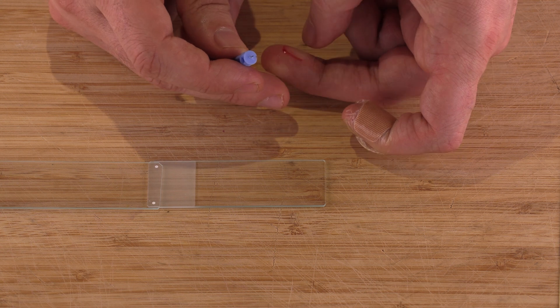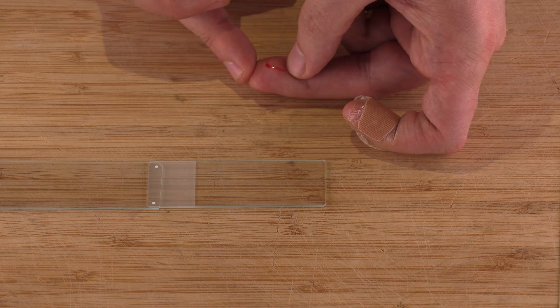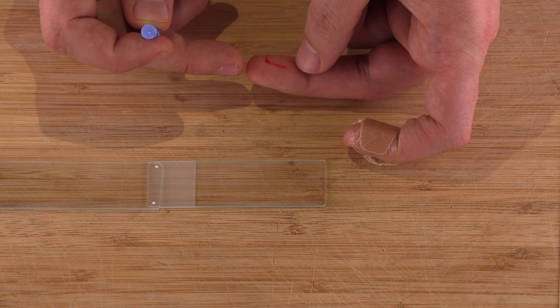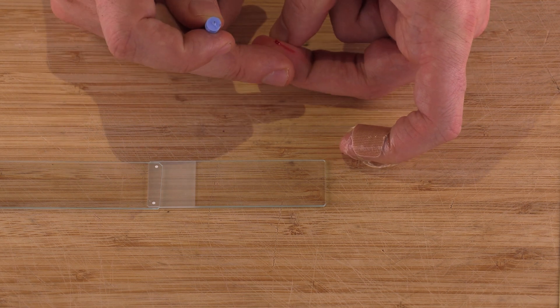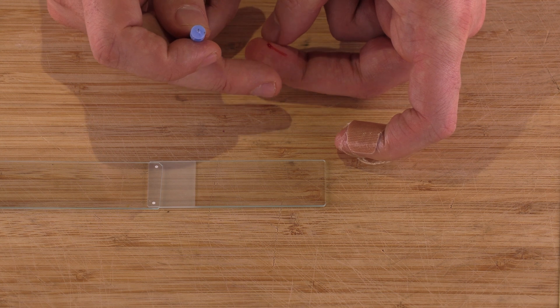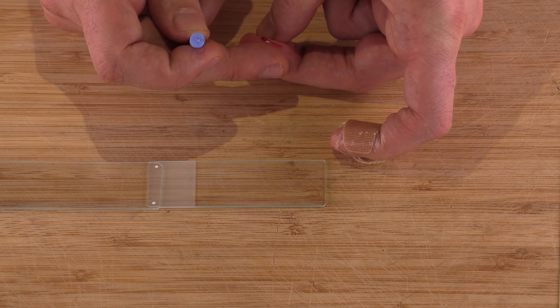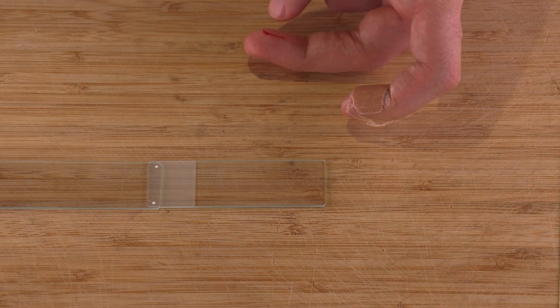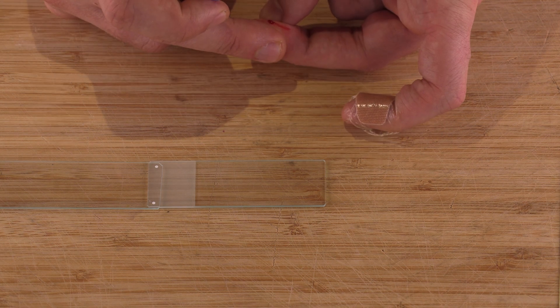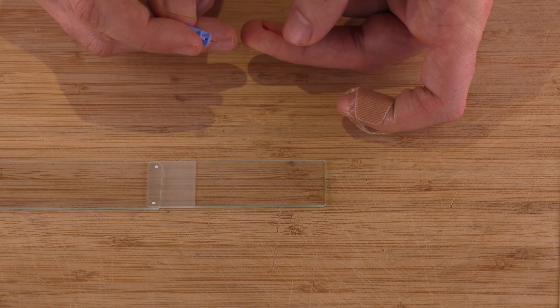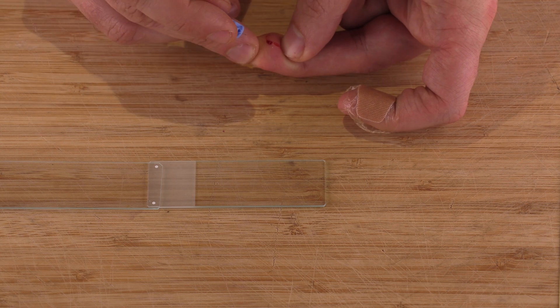Just go easy on it and now I'm trying to just squeeze a little bit more out real gentle. You're not trying to force anything. As you can see I'm giving myself plenty of time to do this. I'm not rushing it, just be patient squeezing a little more out, just giving it a real gentle squeeze not trying to force it.